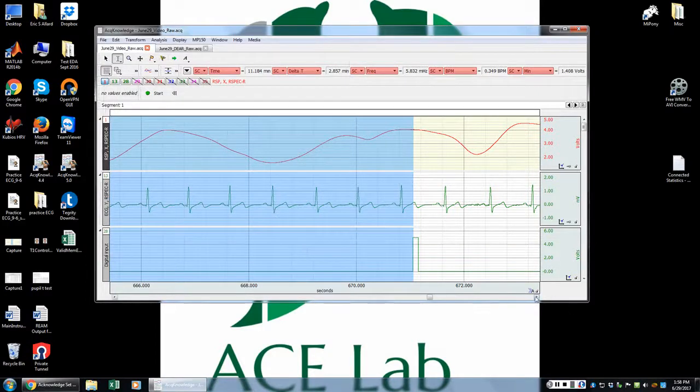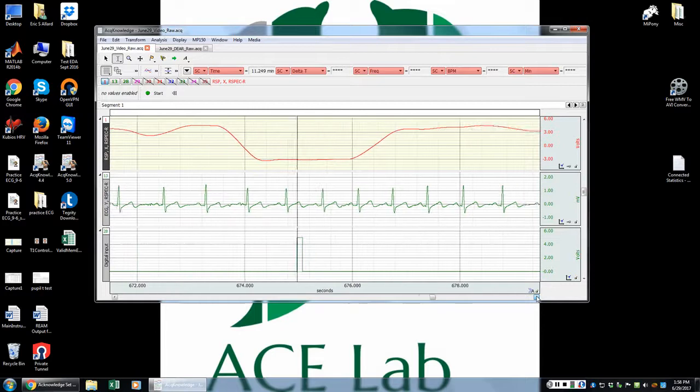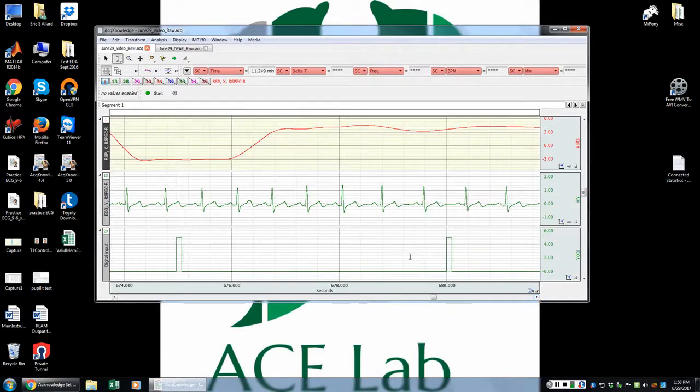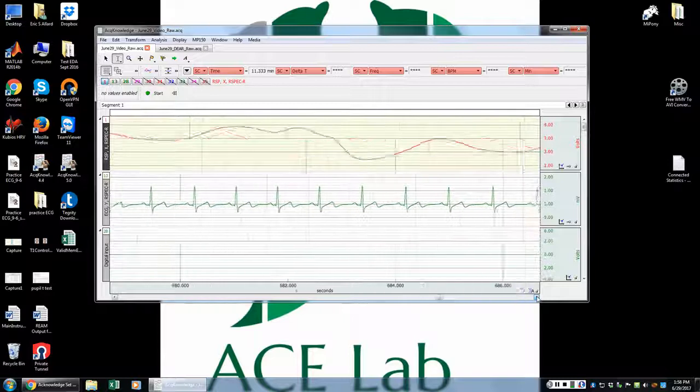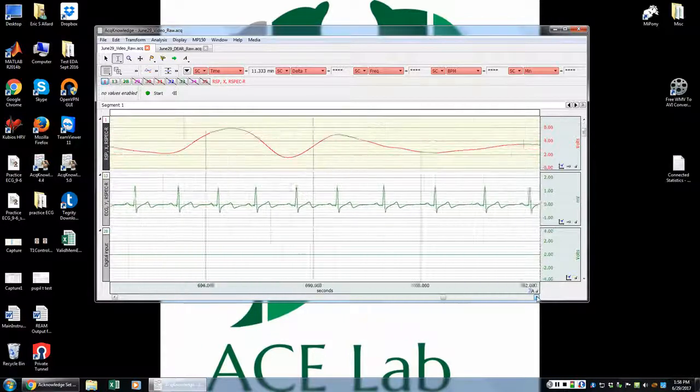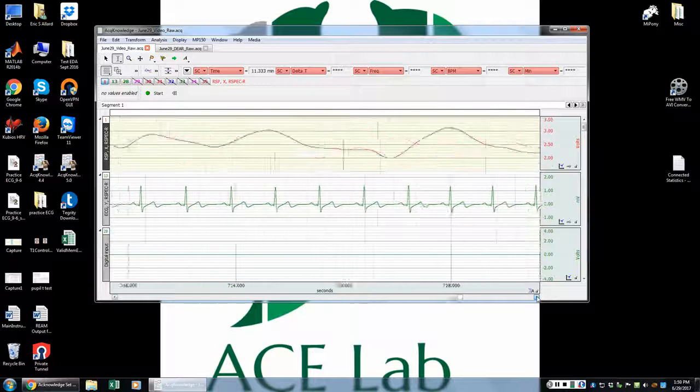Okay, and then lastly, we're going to save our WALL-E video. So again, this region right here corresponds to the questionnaire for the mood rating. And then between these two triggers corresponds to the instruction screen prior to the WALL-E video. And this denotes the beginning of the WALL-E video right here. So again, we'll scroll down. And again, the WALL-E video should be roughly the same length as the other two, somewhere around 2.8 to 3 minutes.